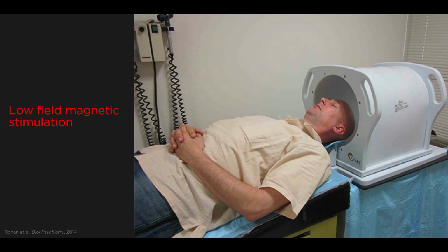Next, I would like to discuss other forms of magnetic stimulation. One of these techniques is called low field magnetic stimulation. It uses an MRI-like head coil, and this technique was discovered at the MGH, where Michael Rohan, the inventor, is shown here. He scanned a number of bipolar patients using a novel echoplanar imaging sequence, and these subjects came out of the scanner reportedly feeling better. And Dr.